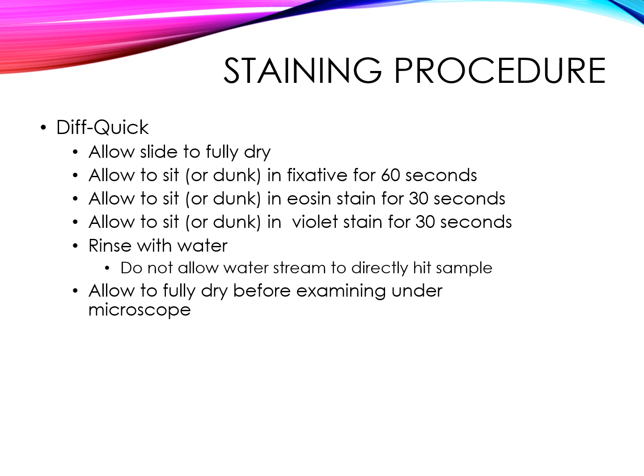So during the DiffQuick stain, you basically either let it sit or dunk it in the fixative. You can let it sit for 60 seconds, or you can dunk it about 10 times. And then you blot off somewhere on a paper towel nearby, or put this on a wee pad, or it depends how the clinic does it. But it's basically you dunk it in here and then you dry it off, and then you do the same thing for the next two.